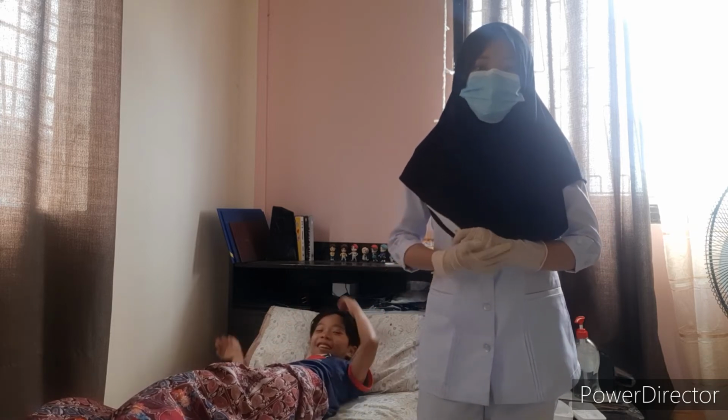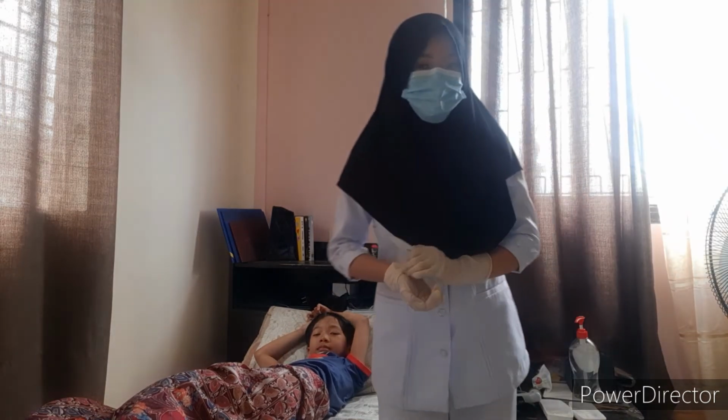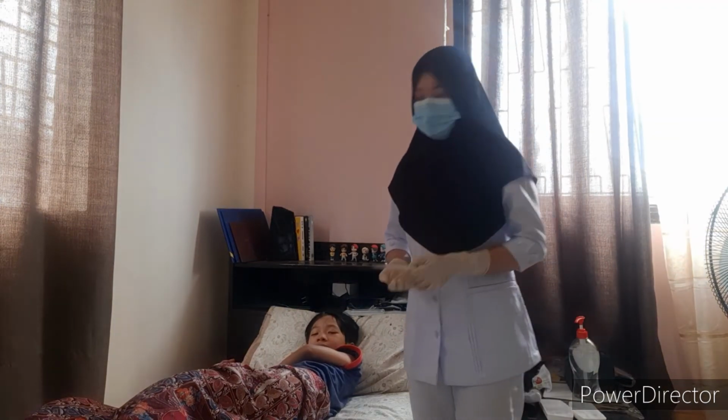So wait a minute or more for the thermometer to beep, then slowly remove it. So this is to provide sufficient time for the recording of the temperature.